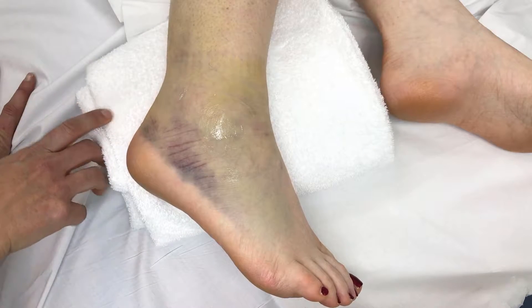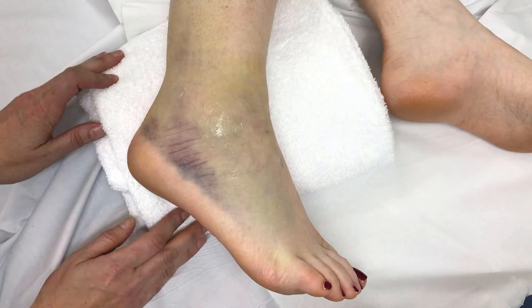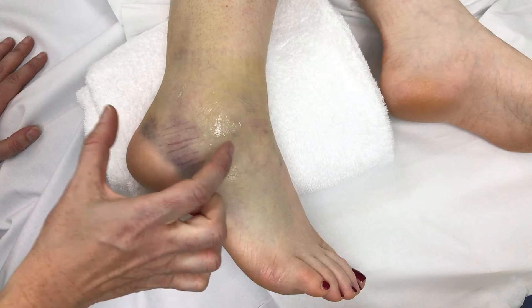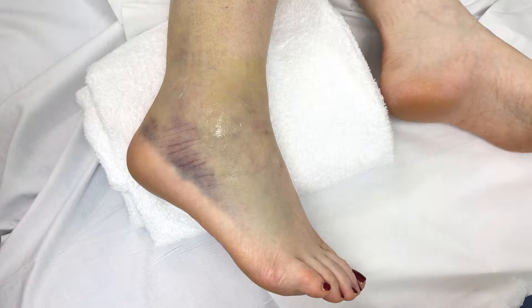There's not a lot of ankle movement when sprains are this fresh, but doing it at five or six days is a lot easier than day one. On day one there's so much blood that it's really difficult to work out which ligaments are sprained, and the movements required to see the ligaments well are obviously very hard to perform.